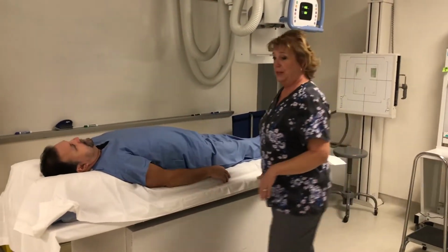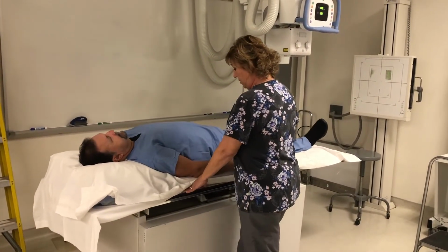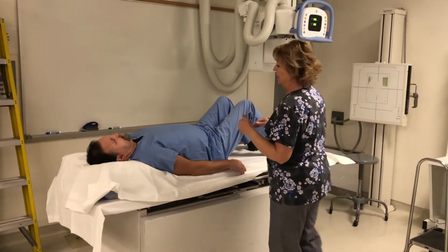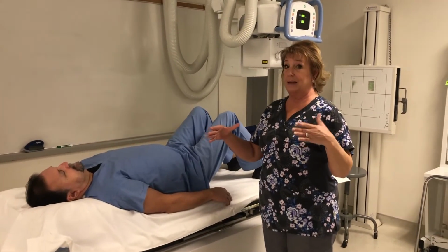Generally, when you have patients that come in and they're being x-rayed due to back pain, they're going to want to bend their legs, because being in a supine position accentuates the lordotic curve of the back and makes them more uncomfortable.